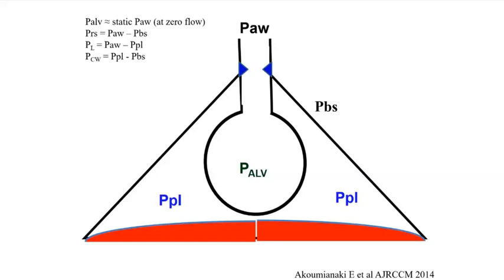The second interesting use of esophageal pressure or pleural pressure is to know what the respiratory muscles are doing. You see on this illustration, the red part is the diaphragm. And the only way to really quantify what the respiratory muscles are doing is to measure directly the pleural or the esophageal pressure. So we'll separate the two: controlled mechanical ventilation and active spontaneous breathing of the patient.